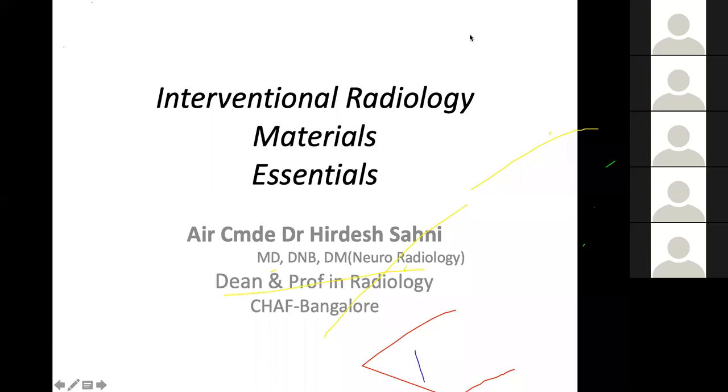Dr. Rishabh Bhatia is asking how many centimeters a gun shoots in a semi or a fully automatic needle? Okay, so the answer to this is these are available in different sizes, and the usual throw, we use the term throw, is about 20 millimeters. There are also guns which are available where you could choose whether it fires 1 centimeter or 2 centimeters. So the usual throw is 2 centimeters. At least I haven't seen a needle which has a throw of more than 2 centimeters.